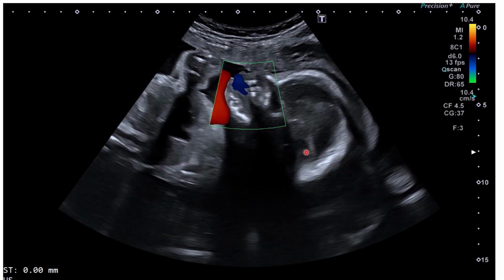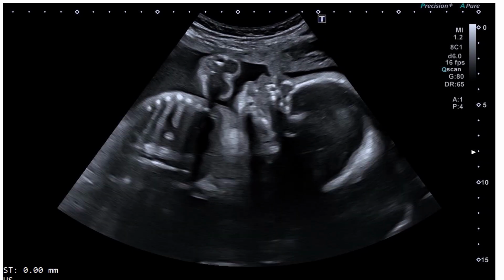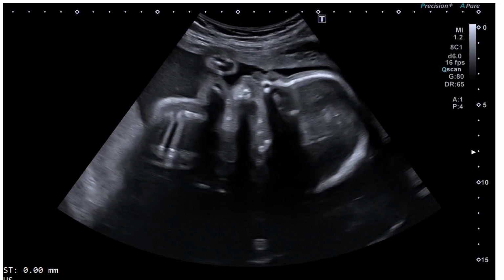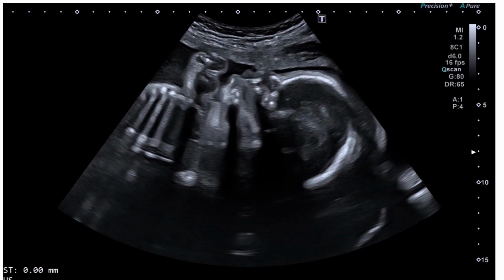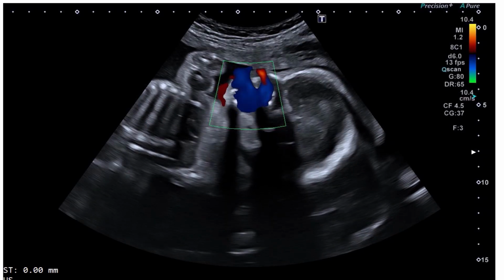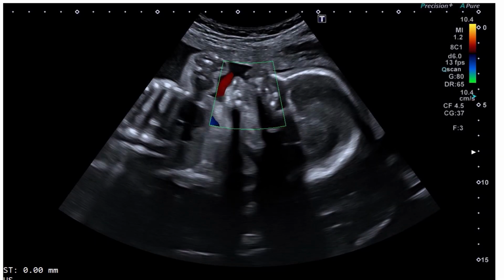These are some of the skills that you need to cultivate if you are going to do a complete fetal scan. But most of you are doing detailed scans, yet you are not able to do these basic scans, and you can't do the fetal biophysical score.